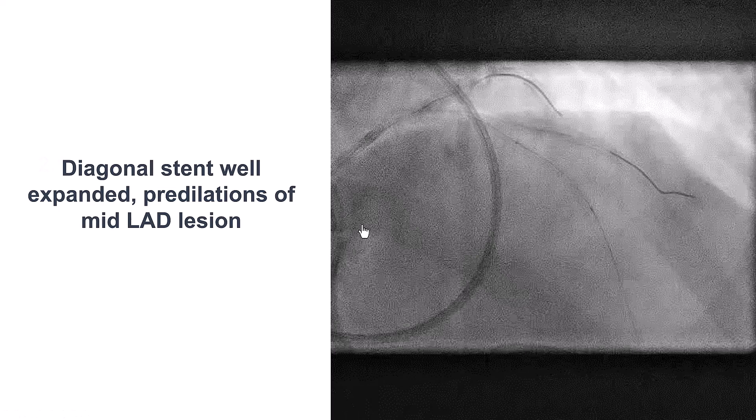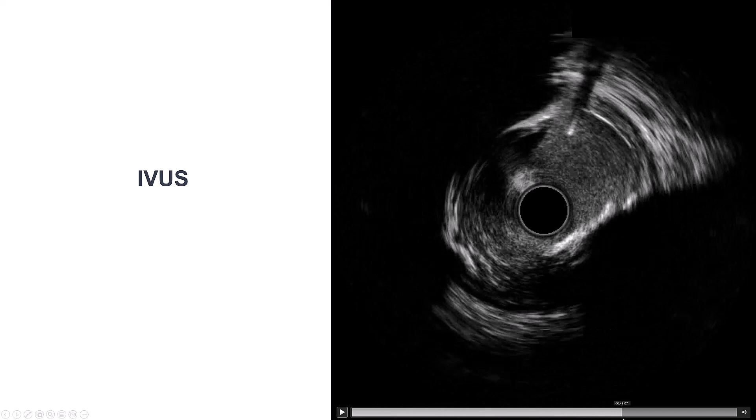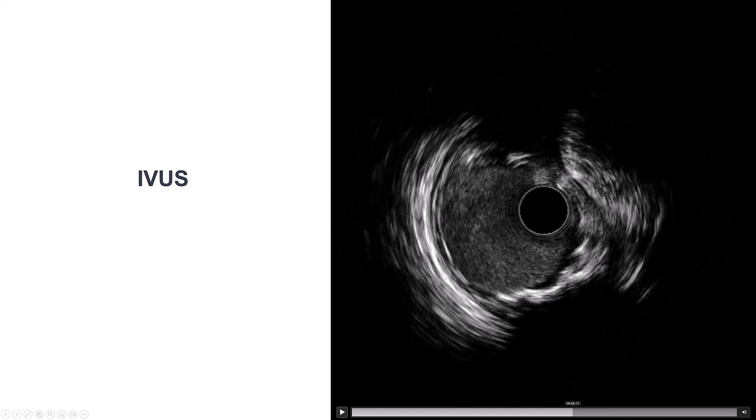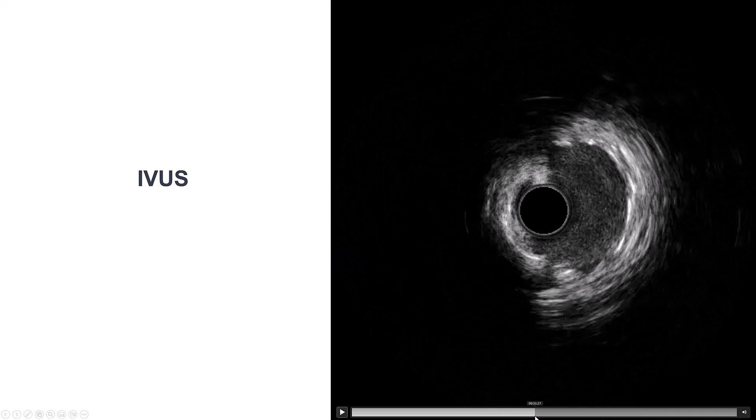There was disease in the middle LAD that was covered with a long drug-eluting stent. IVUS — as a consistent theme for any complex PCI, for heavily calcified lesions especially, doing intravascular ultrasound or optical coherence tomography is critical to make sure that we have good expansion. We do have this oval deformation, we do have the bifurcation of the left main — diffuse disease, calcification — but overall expansion is okay.